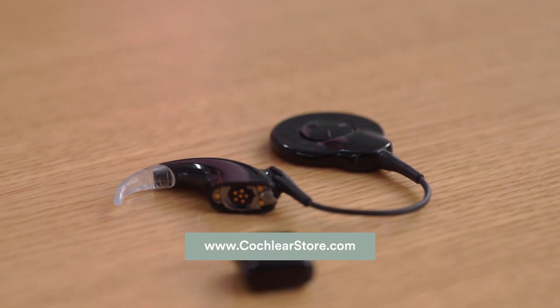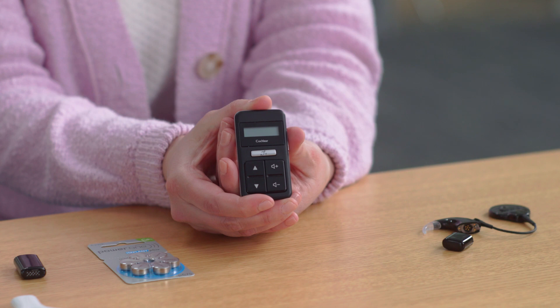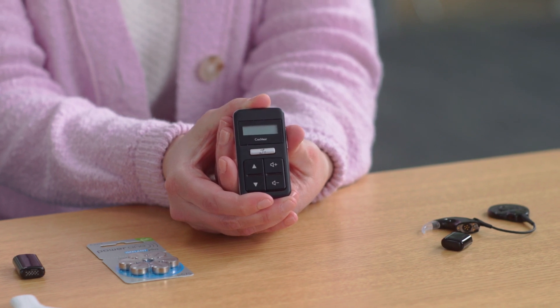If you're not utilizing the free Cochlear Nucleus Smart App with a compatible smartphone, you'll want to use the Cochlear Remote Control to adjust your volume, programs, and activate streaming from wireless devices. This is an optional, complimentary item that may be in your kit if selected by you or your audiologist.